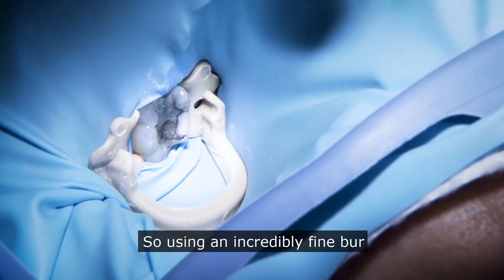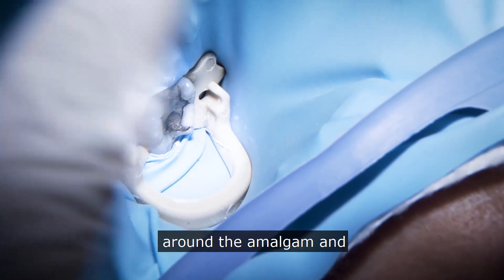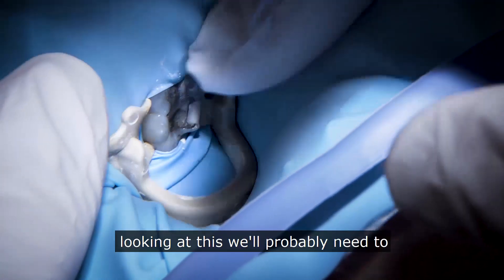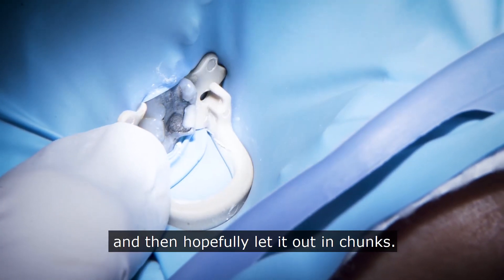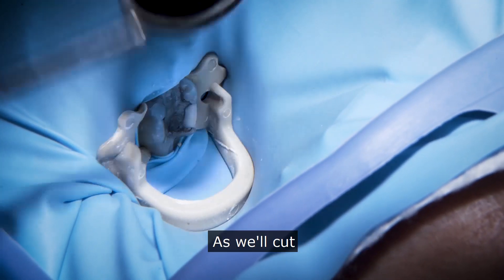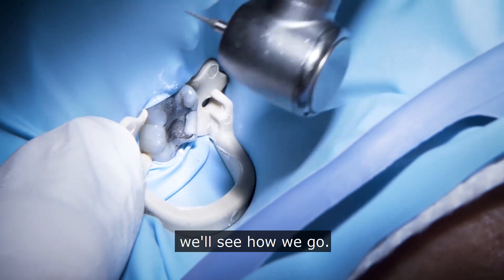Using an incredibly fine burr, we're just going to put a little channel around the amalgam. Looking at this, we'll probably need to put one cut through it and then hopefully lift it out in chunks. It's well cut — we'll see how we go.